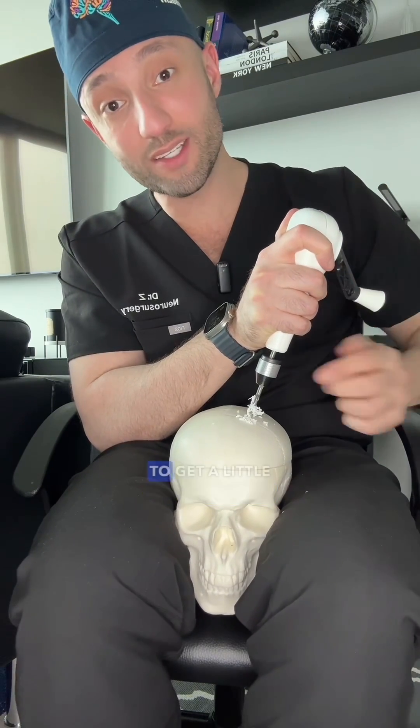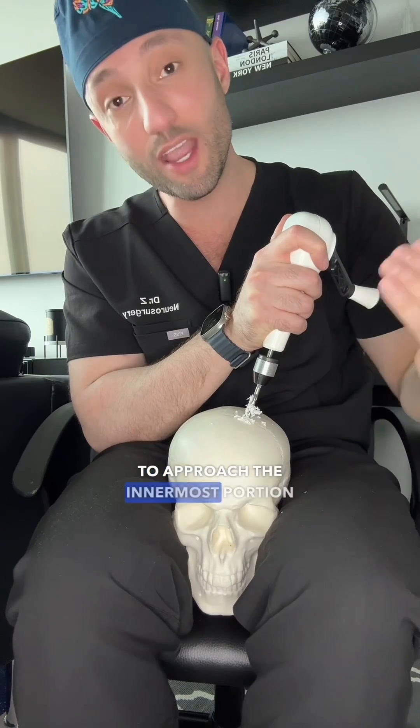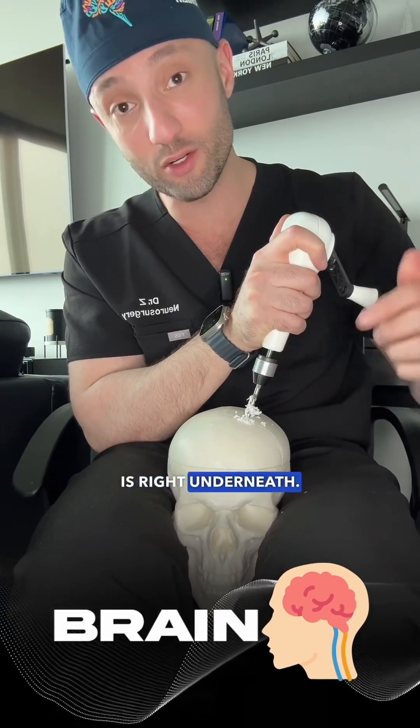I'm starting to get a little bit of resistance here. That's an indication that I'm starting to approach the innermost portion of the skull, which means the brain is right underneath.